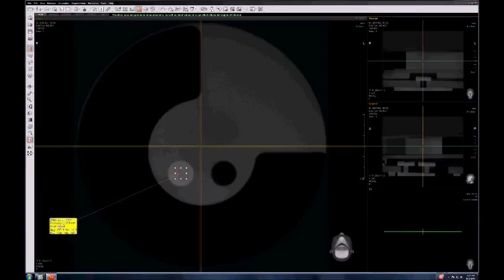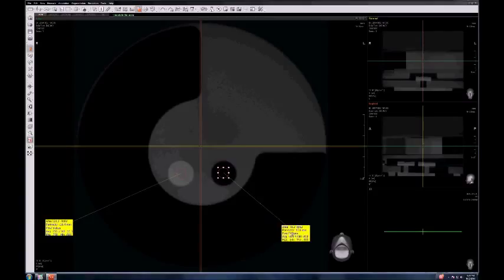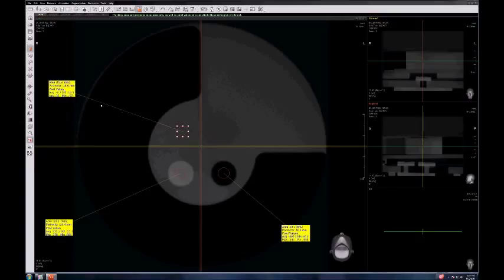This is for Teflon first. As you create those regions, you will see in the label what values they have. Those three regions are air, Teflon, and water.